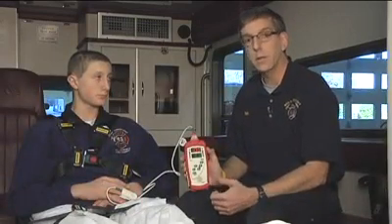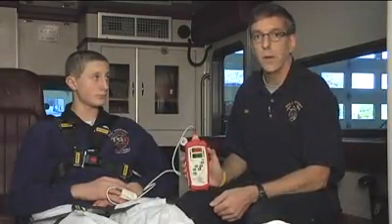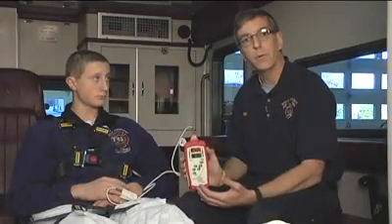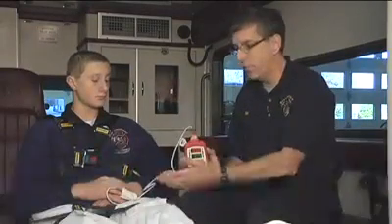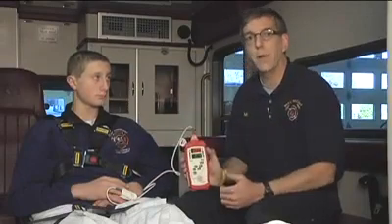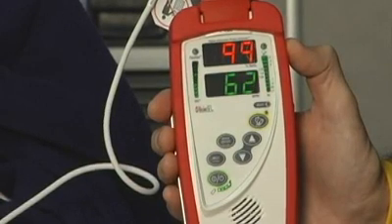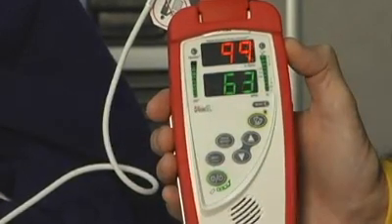We talked in another Fire Engineering video series about using pulse oximetry to take blood pressure. If you were trying to assess a blood pressure, you could place the probe on the extremity, pump your blood pressure cuff up on the same extremity, and watch for the pulsation as you let the air out of the cuff to get a rough idea of a systolic blood pressure.